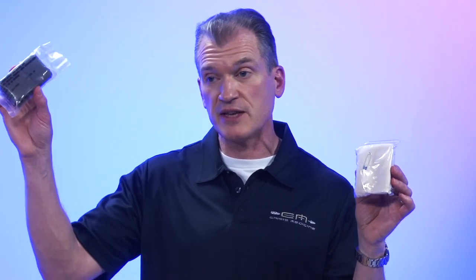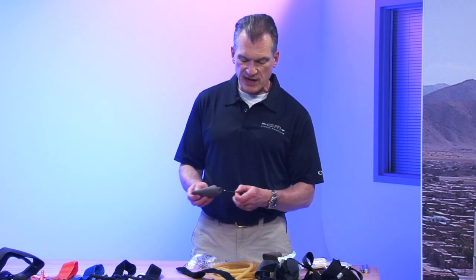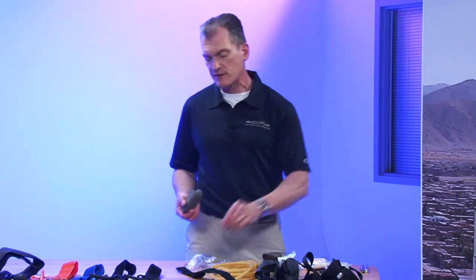Military cravats or military triangular bandages are very different than their inexpensive civilian counterpart. These are about six bucks and they're much more stout material. These are about 79 cents a piece. The military cravats come out of the plastic wrap and they have two safety pins in them that can be used for a lot of different things.